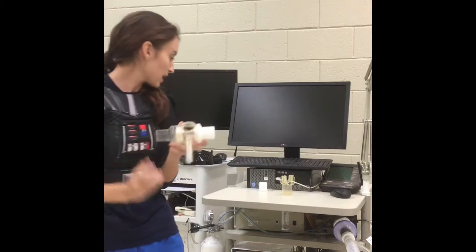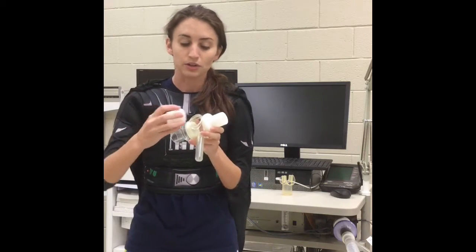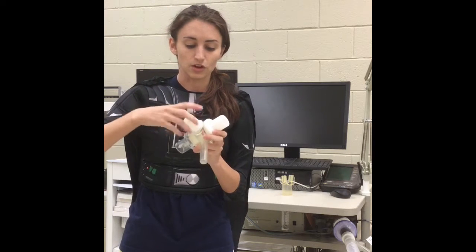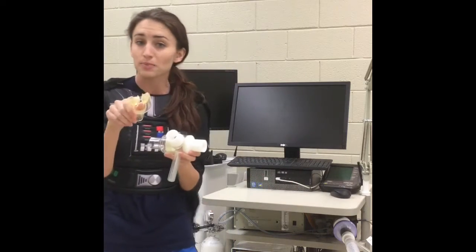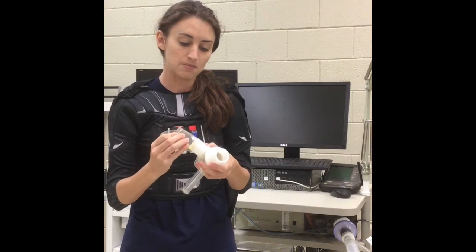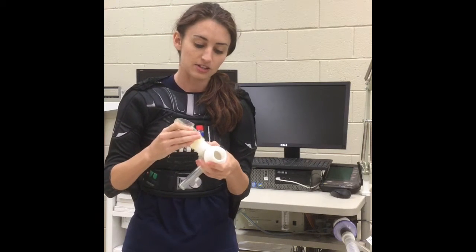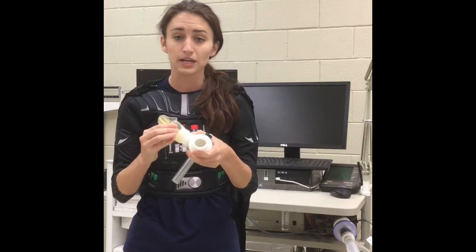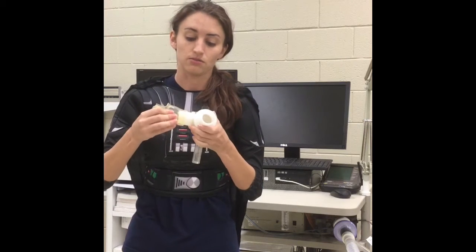Next we have the mouthpiece to put on. First you have to put a little connector on and screw it in. Then you have the actual mouthpiece that you put in the participant's mouth — pinch to put it on, and allow about a quarter of an inch from the actual silicone mouthpiece to the main part of the valve.